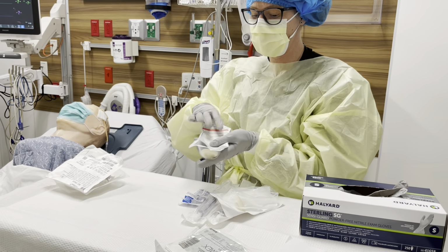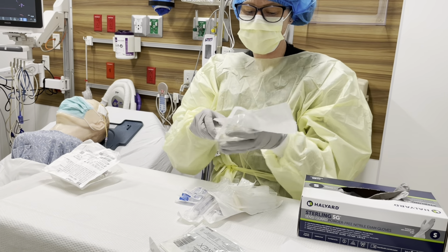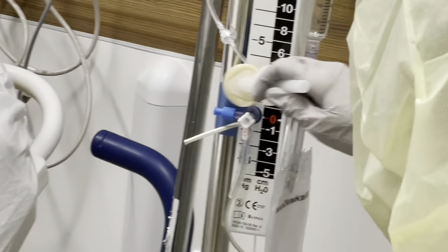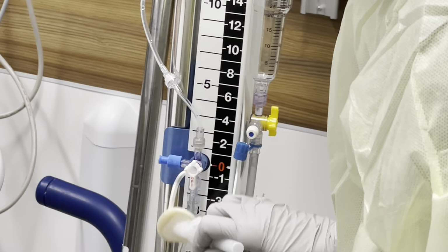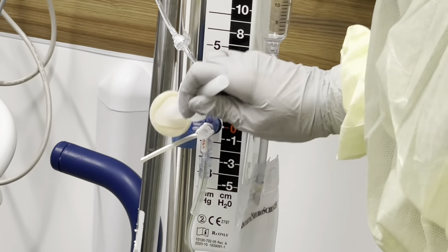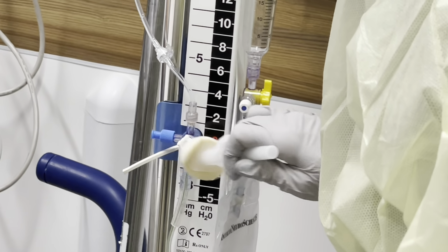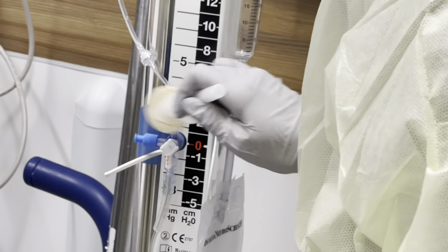So again, we're gonna open this and pop. Make sure that you got it nice and moist in there, and then you're gonna clean all around here. You're gonna make sure that everything is nice and clean, because you're not trying to have any kind of bacteria anywhere around the site. A lot of times, when we're coming out of OR, we're gonna touch things. It's gonna be in the bed, all kinds of stuff. So we're just gonna make sure all of this is as clean as it can possibly get. Okay, once we know that that's been nice and clean, a good 30, 45 seconds, we're gonna let it sit in air.